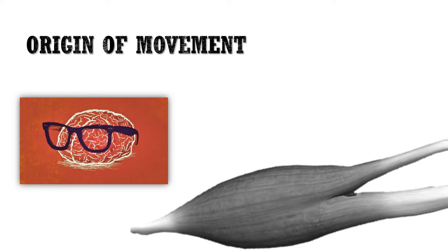Now remember that surface electromyography is a technique that, and this is crucial, does not measure muscular force. I can't overstate that enough. It measures muscle activity, which I like to simplify and think of as the effort put into generating force, as opposed to the actual force output itself, which is the product of the effort. That's my simplified explanation for it. That's how I always understood it.